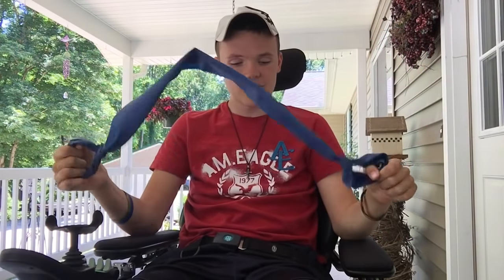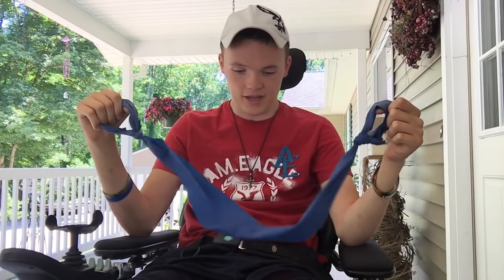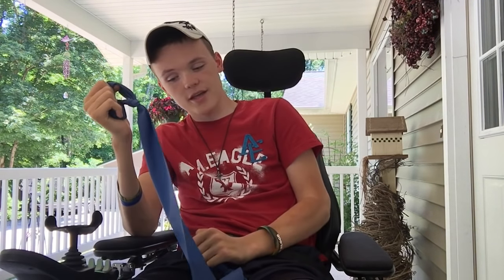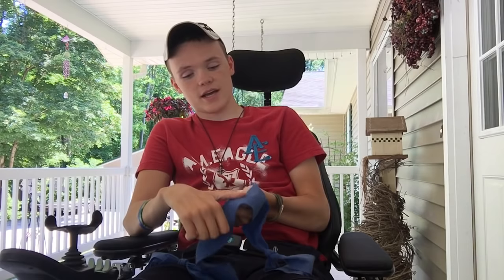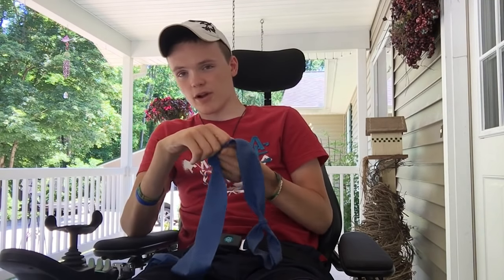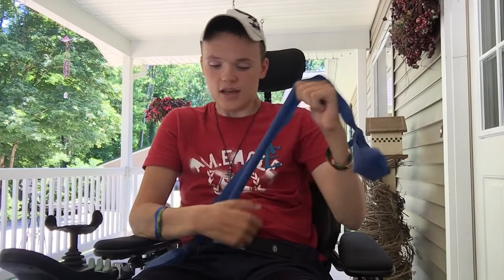Alrighty, in this video, I'm going to be showing you how to do some stretches and things with this thing here, which is called a TheraBand. What this is, it's latex free. They make some with latex, but this one's latex free, and I like it a little more because it has a little bit more grip. It's not as plasticky. It's more kind of rubbery, and it's not as slick.